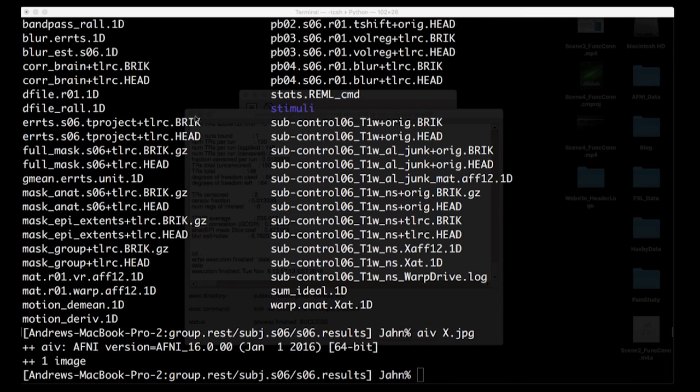And starting about here is where that 1dBport is starting to model out a lot of your frequencies. So notice dark, I may be getting these mixed up, but let's say dark is lower and lighter is higher, right? So this is like a really low frequency sine wave that you can, if you imagine it kind of coming out towards you as it's getting lighter. Another frequency, a little bit higher frequency, higher frequency, higher frequency. And then there's a jump to really high frequencies. Remember, the frequencies between 0.01 and 0.1 have been effectively removed from this model. Everything else we're putting into the model because we want to model that out of our data, filter it out.